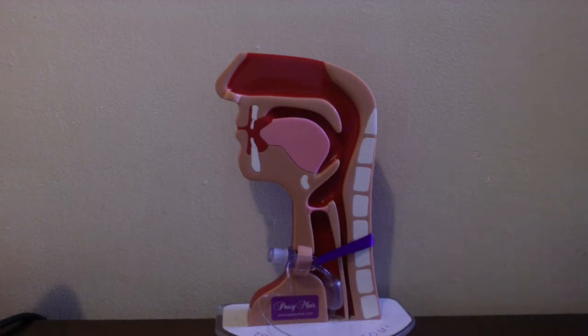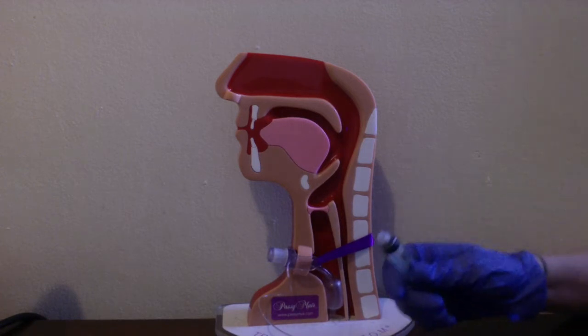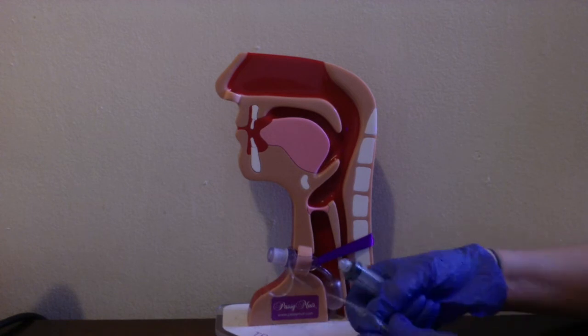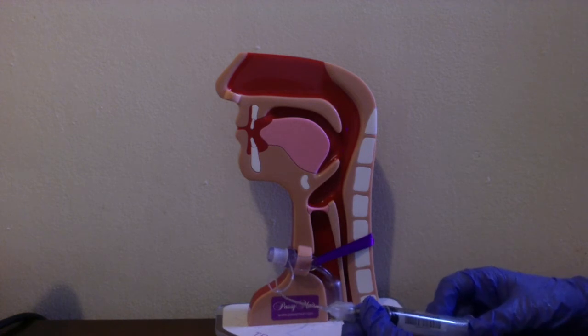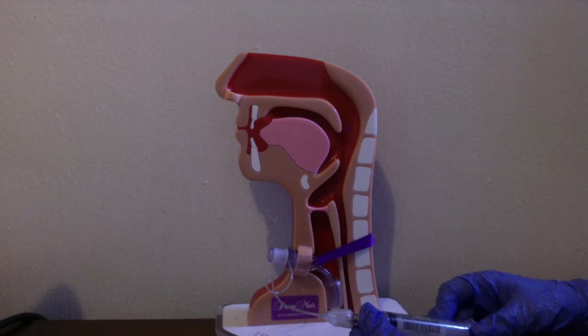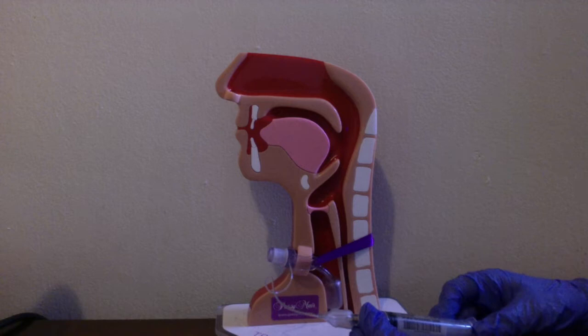To deflate the cuff, first take a 10cc syringe and place it inside the pilot balloon. We want to slowly deflate the cuff while suctioning the patient. If the patient has secretions, we might want to suction the patient before deflating the cuff or use subglottic suctioning if that's available.